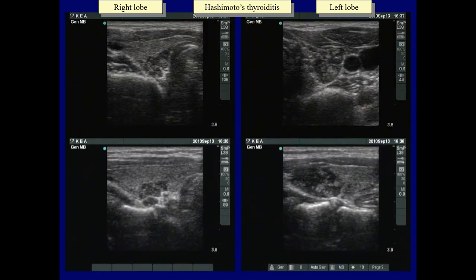The four images come from the same patient. This is an unusual presentation of Hashimoto's thyroiditis: only one relatively large hypoechoic discrete lesion is found in both lobes. The presence of fibrosis, the puzzle-like borders, and the presence of smaller hypoechoic areas are the signs which raised doubt about the nature of the lesions and raised the possibility that these lesions are not nodules in a pathological sense but an unusual presentation of lymphocytic thyroiditis.